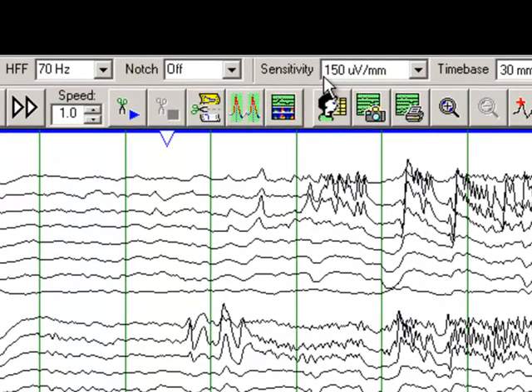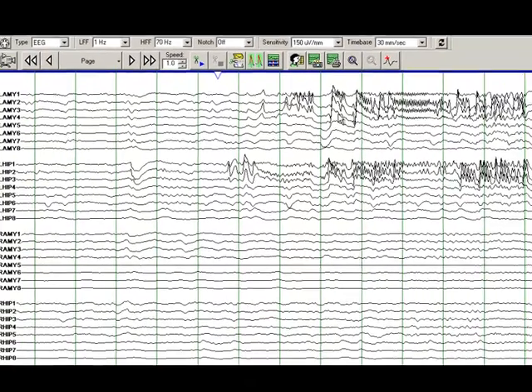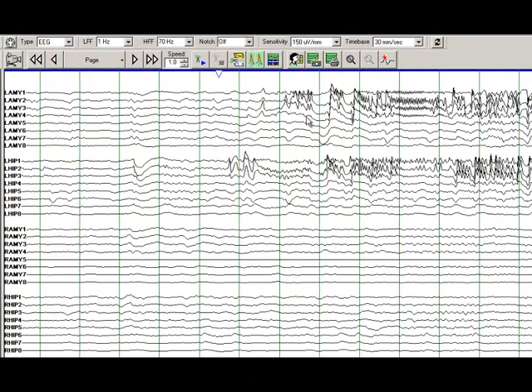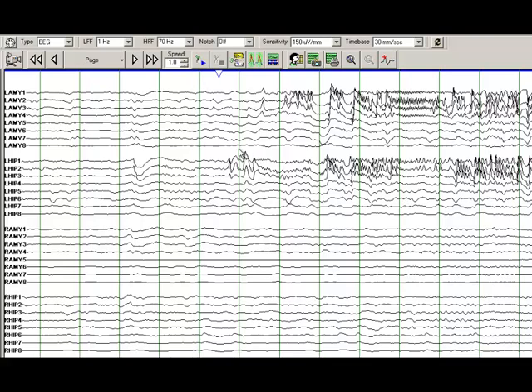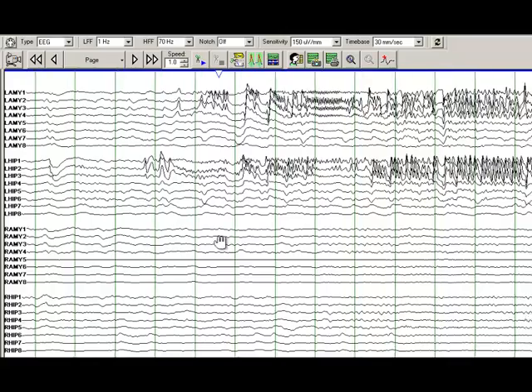A few other things that you need to note is the sensitivity. Normally when you are recording scalp recordings, you are looking at a sensitivity of 7 µV per millimeter. Here you have a sensitivity of 150 µV per millimeter, so these are very high amplitudes. The sampling rate, although not shown on this recording, we are using a sampling rate of 2000 Hz for intracranial recording. And you can see a very clear onset of the electrographic seizure from the left hippocampal contacts.